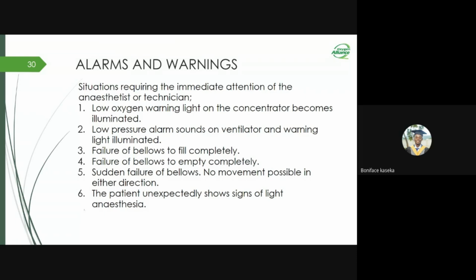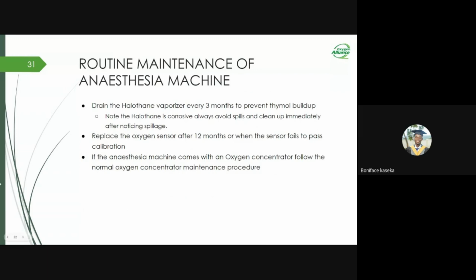And moving to the next slide, I am going to explain to you the routine maintenance of the anesthesia machine, as it is also like any other machine that needs to be working perfectly in all conditions.